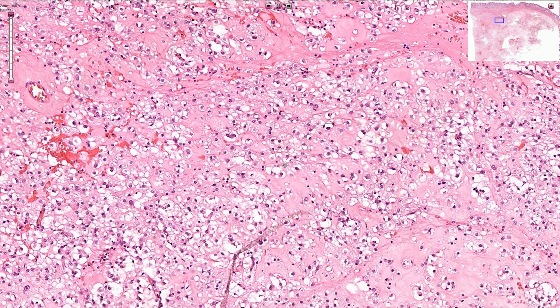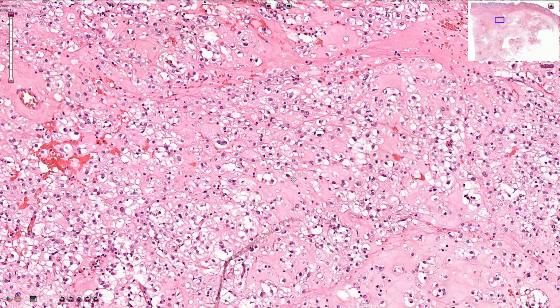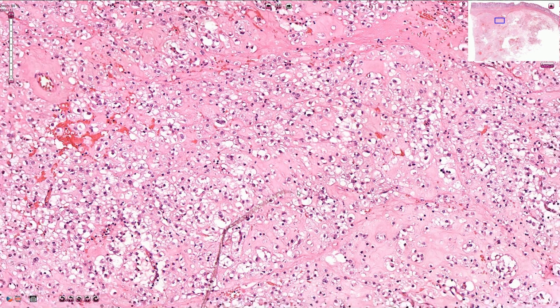Gastrointestinal stromal tumors are typically positive for CD117, which is an immunohistochemical antibody that stains mast cell growth factor receptor. DOG1 is a relatively new immunohistochemical antibody that is also quite useful, but we need to be careful because part of the gastric adenocarcinomas could be positive as well.